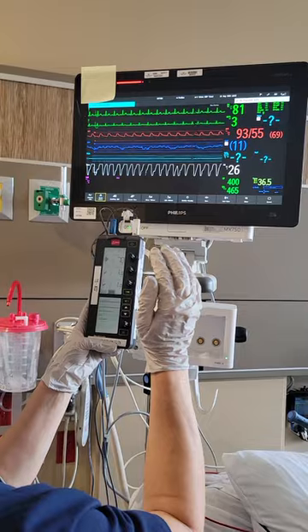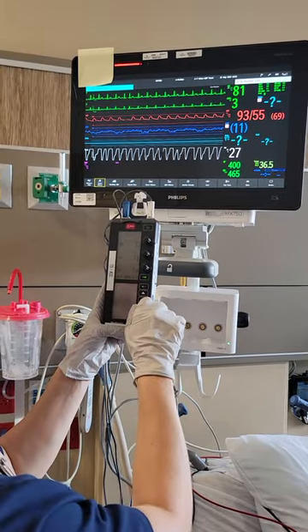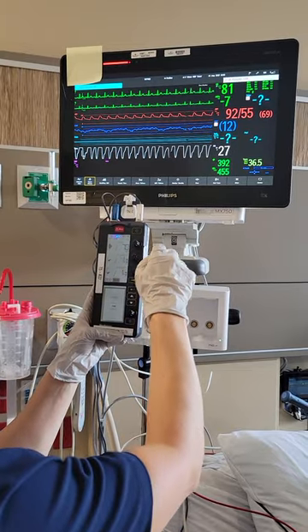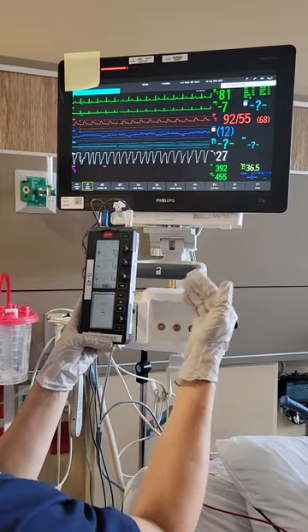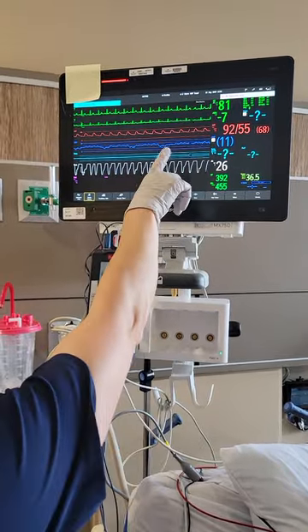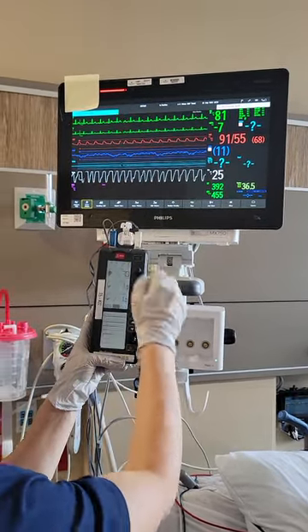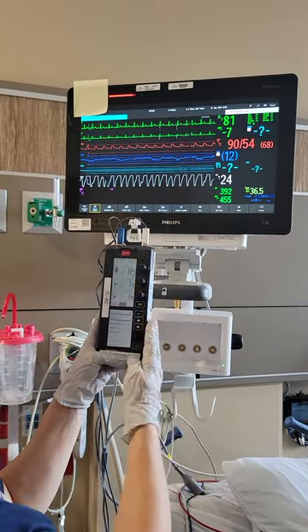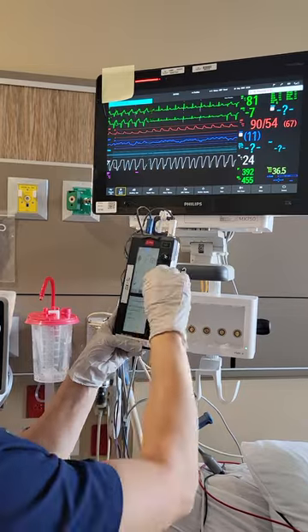Now that we've done sensitivity, I turn the sensitivity back down well past half — we want the sensitivity usually all the way down. Now we're going to check for the outputs: how high does the MA output need to be to get the response that I want? We check those one at a time. To do that, you have to set your rate higher than the patient's intrinsic rhythm, so we're going to go up to 84 just to make sure. We're going to check these one at a time.